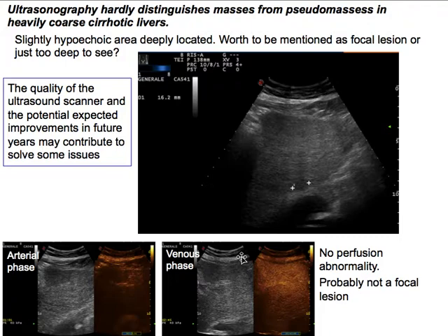Moreover, livers might be inhomogeneous, so they might present pseudo lesions, and this might cause problems in indicating whether these regions deserve further investigation with contrast or not.